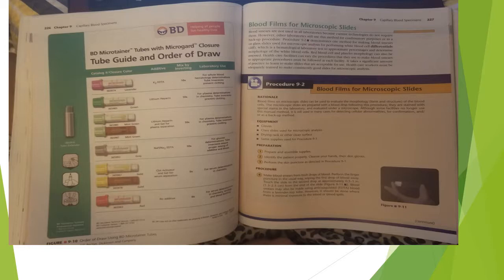Procedure 9.2, blood films for microscopic slides. Blood films on microscopic slides can be used to evaluate the morphology, or the form and structure, of the blood cells. The microscopic slides are prepared with a blood drop following this procedure. They are stained with special stains in the laboratory and evaluated under a microscope. Although some facilities no longer use this manual method, it is still used in many cases for detecting cellular abnormalities, for confirmation and/or as a backup method.